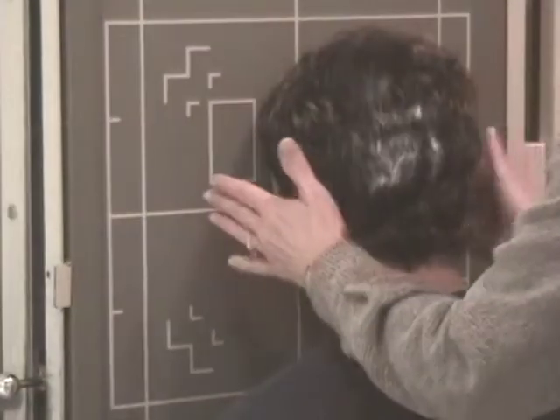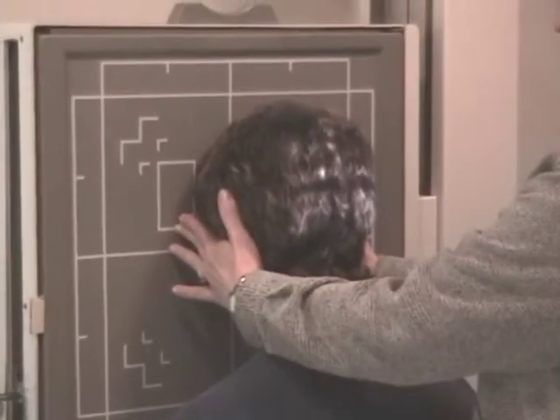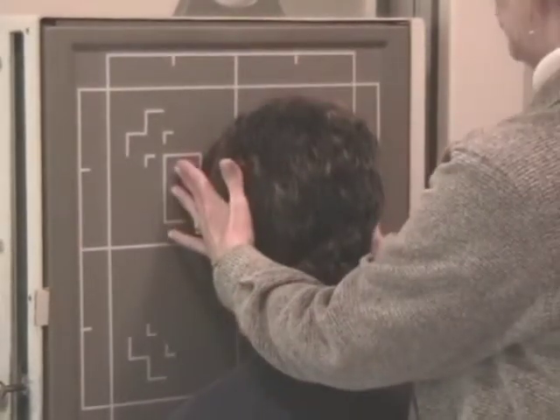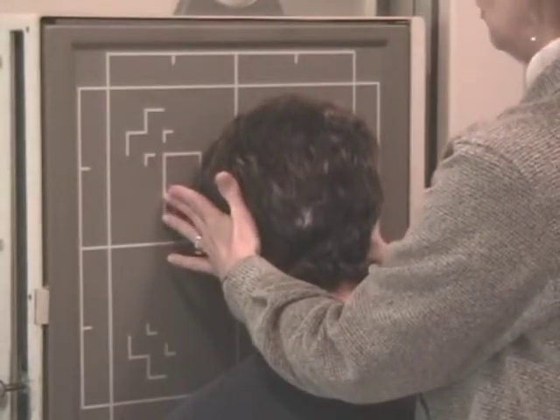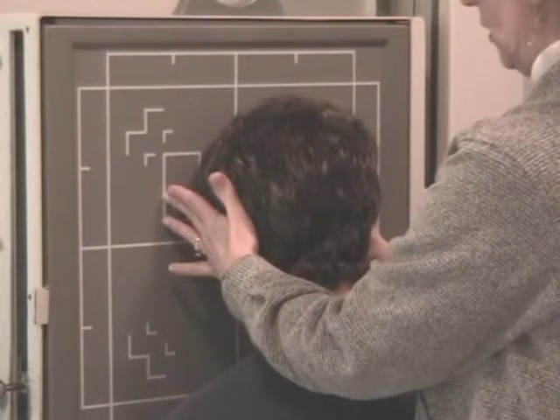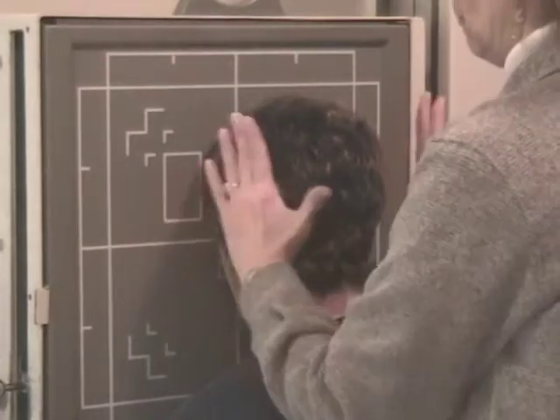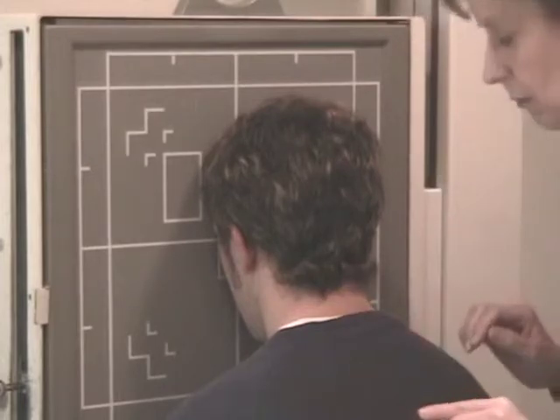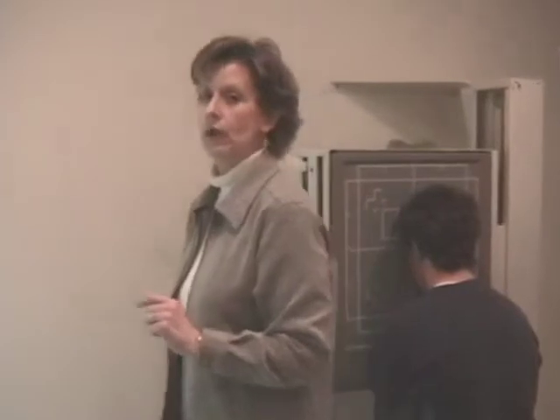Step behind your patient. Make sure the MSP, the mid-sagittal plane, is to the center of the film. You can look at the light on the back of the skull. You can look at the line on your vertical board. And then I'm going to feel for the skull like we've talked about before to make sure that the skull is in a true PA position, that the MSP is perpendicular. Feeling mastoid tips, reaching the board, making sure they're at the same level height. And this would be a PA axial, also known as the Caldwell.